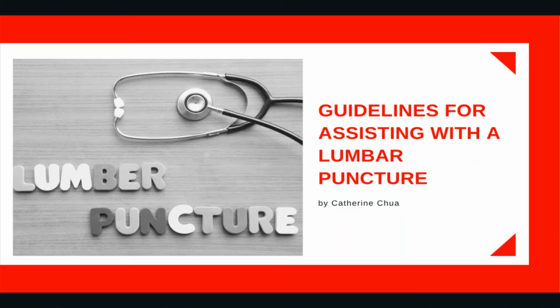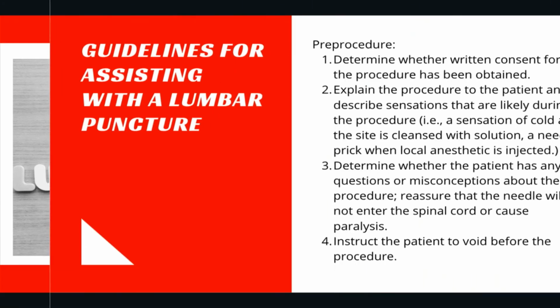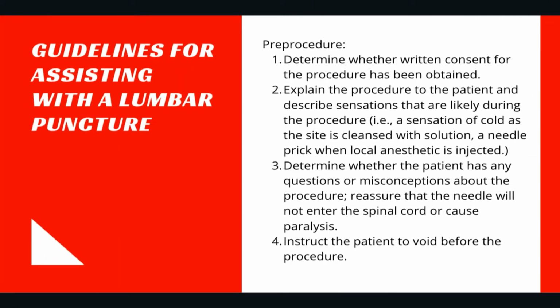The guidelines for assisting with a lumbar puncture. A needle is inserted into the subarachnoid space through the third and fourth, or fourth and fifth, lumbar interspace to withdraw spinal fluid. These are the pre-procedure guidelines for assisting with a lumbar puncture.